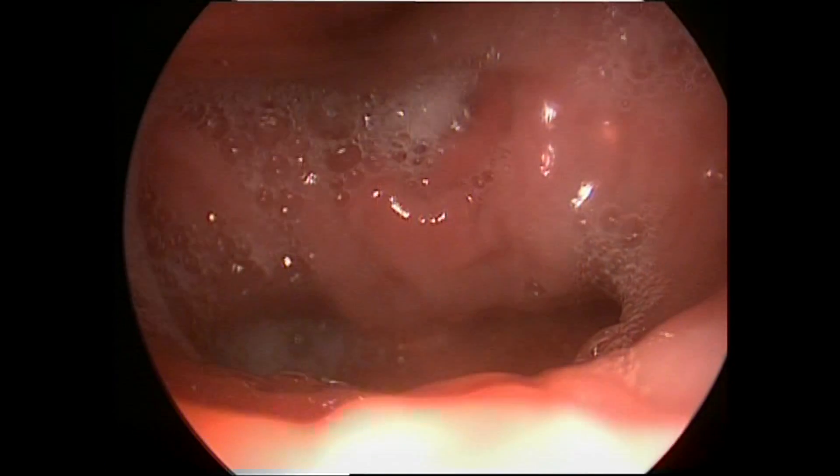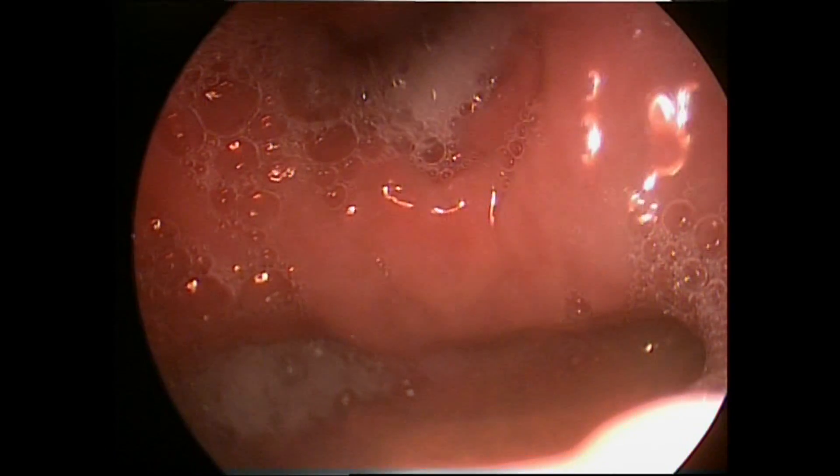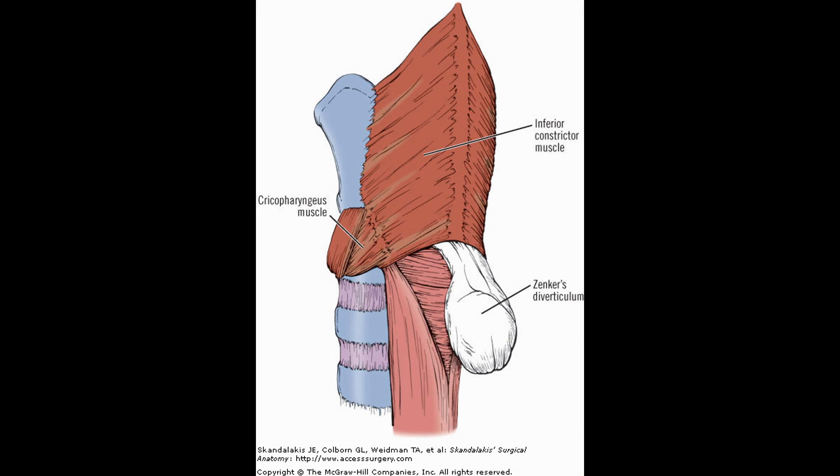Occasionally, food particles can be seen in the diverticulum in this view. In this picture, we can see the pulsion type diverticulum originating from the Killian triangle just above the cricopharyngeus muscle.